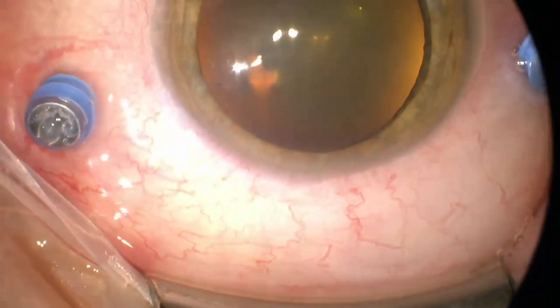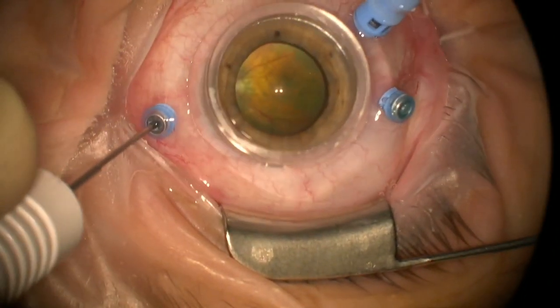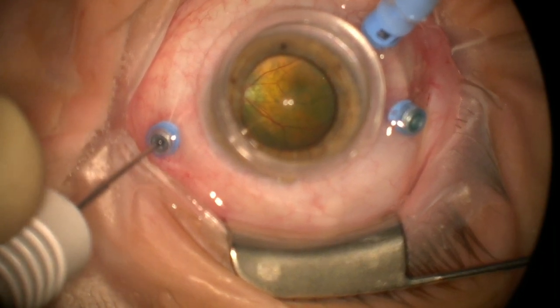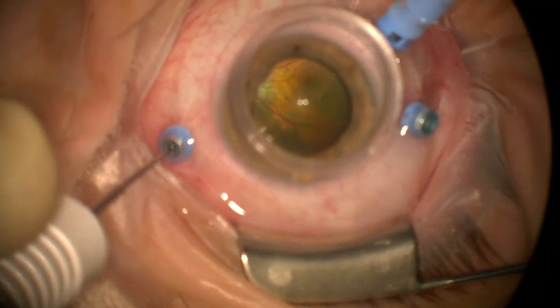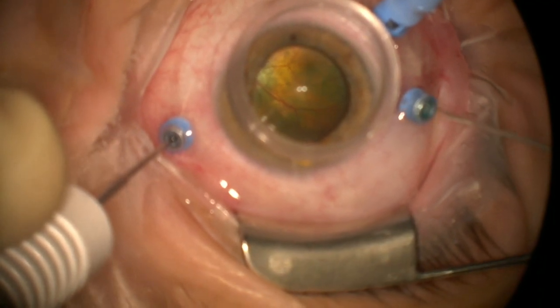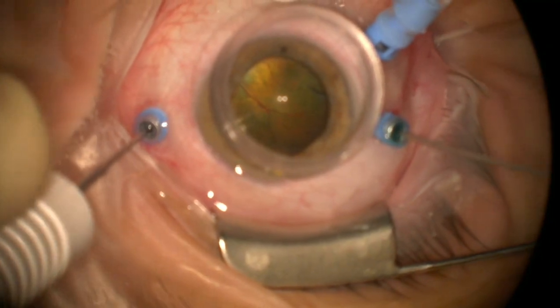A little bit of light, huh? And we'll try and keep the image pretty nice. Let me show my normal technique, which is the pic. I'm going to show you how I do most of my cases, and there's a reason for this. So we're going to start with the pic here.